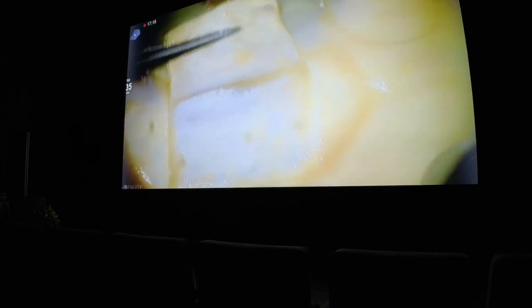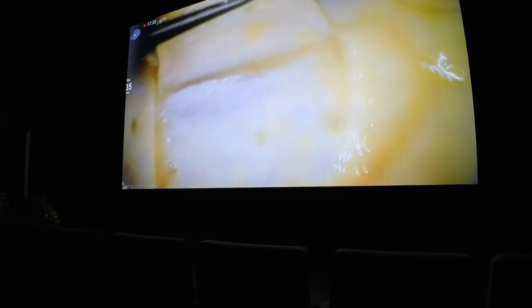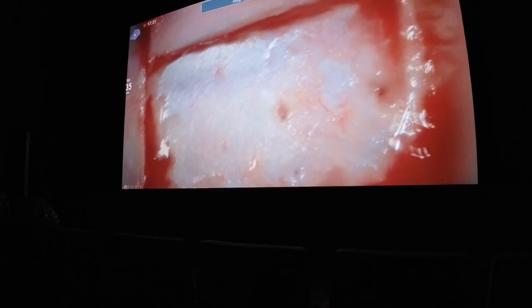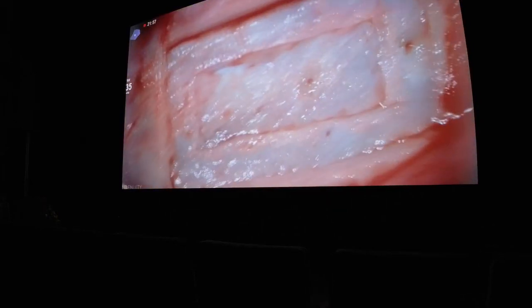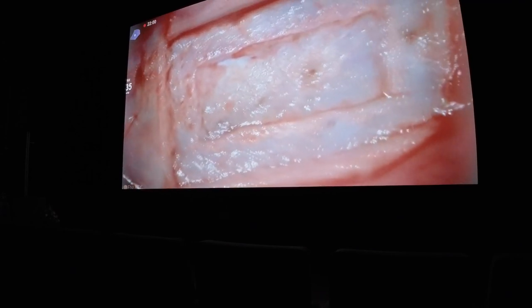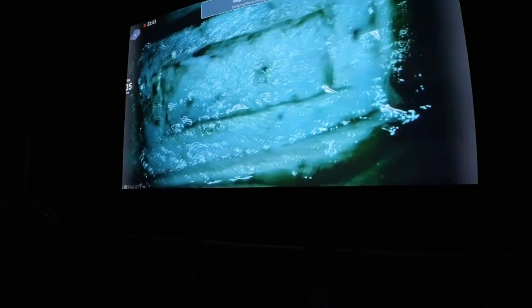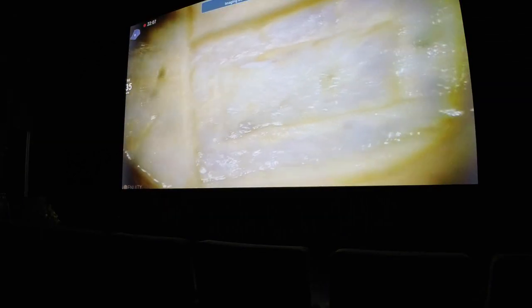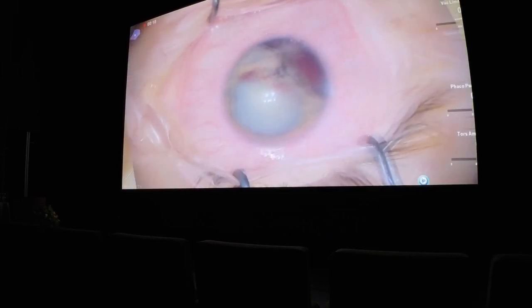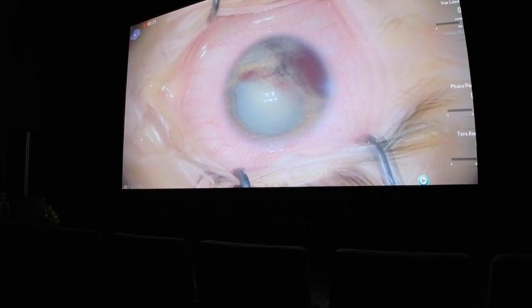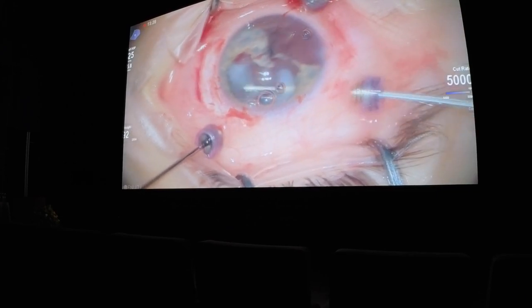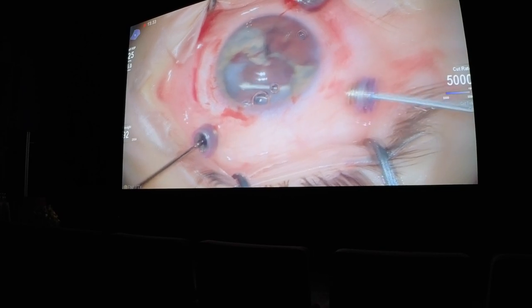Another example of high magnification and digital filter applied over the image — again, this is a case of Express. This is the regular view, and this is another filter I regularly use in procedures where we have a lot of blood. Because nowadays we often share our surgical content on LinkedIn, Facebook, Instagram, and their bots are trained to discover red blood. But when you apply a filter, the blood becomes orange and you escape the bots — so nowadays that might be important.